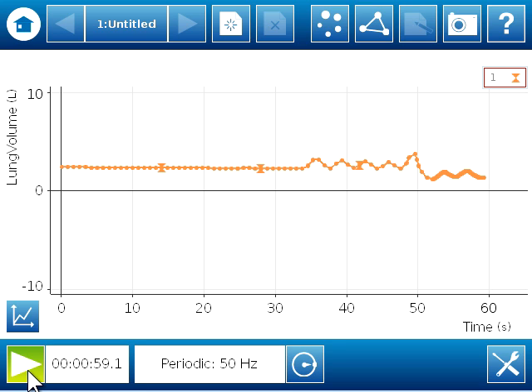So I did a couple of things during data collection. I started out just breathing normally, and then I did a maximum inhale, followed by a forced exhale, and then return to normal breathing.